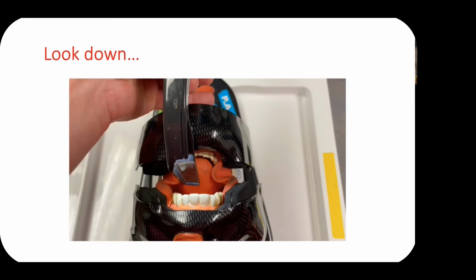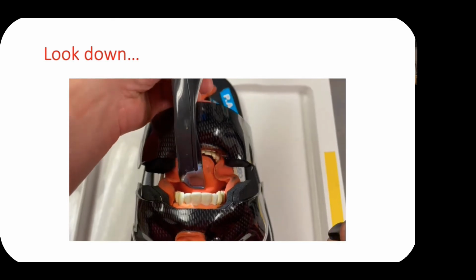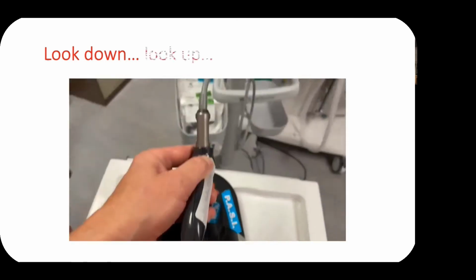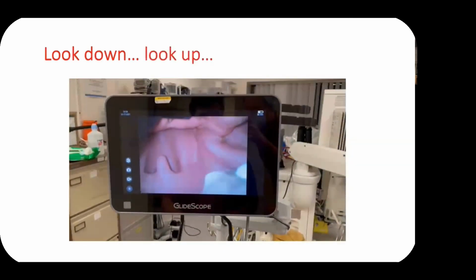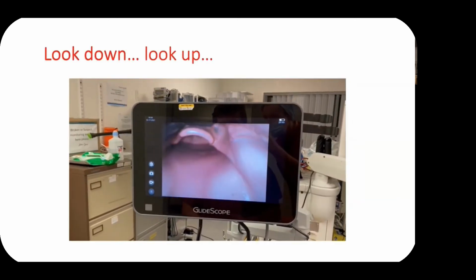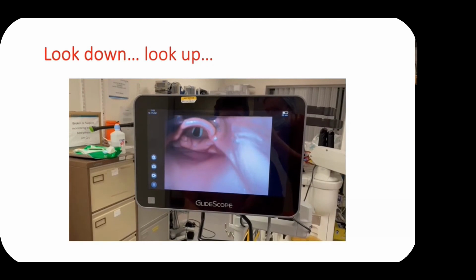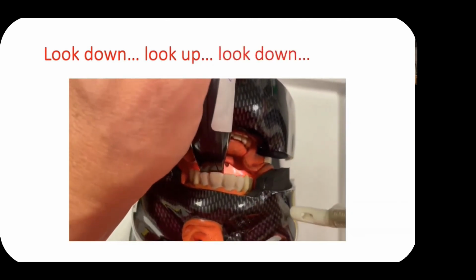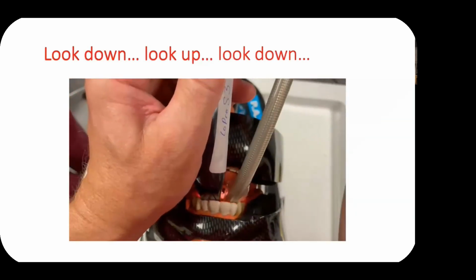Hyperangulated blade technique involves look down, look up, look down, look up. Under direct vision, insert the lubricated blade into the mouth over the midline of the tongue. Then look up to the screen and continue to advance the blade tip into final position. Look down into the mouth and insert the endotracheal tube under direct vision.